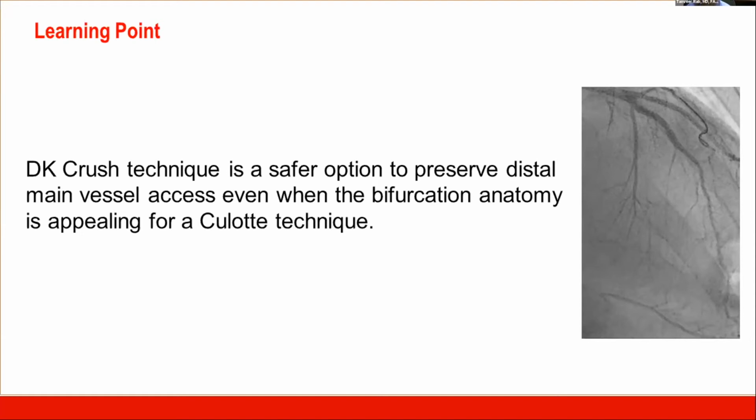And the other thing is when you have a wire or balloon as a marker, the central lumen of the balloon, when the tip of the stent balloon touches the other marker, it's probably 1 or 2 millimeters into the vessel. That's a reasonable indicator that you're well within the vessel. If your tip marker with a stent from the side branch touches the middle lumen where the wire goes through, those two give you a reasonable idea that you have enough stent within the lumen of the vessel.